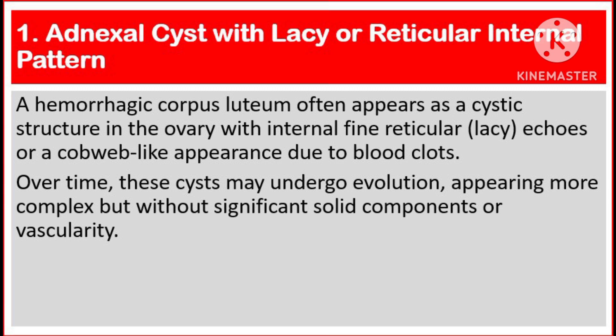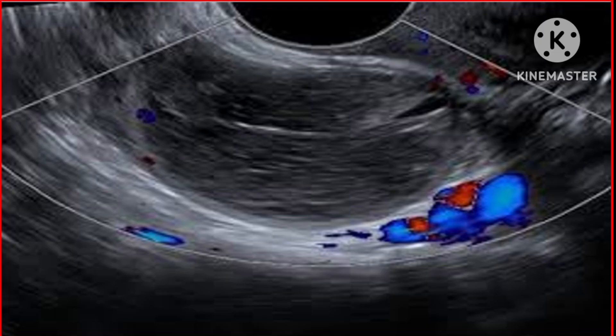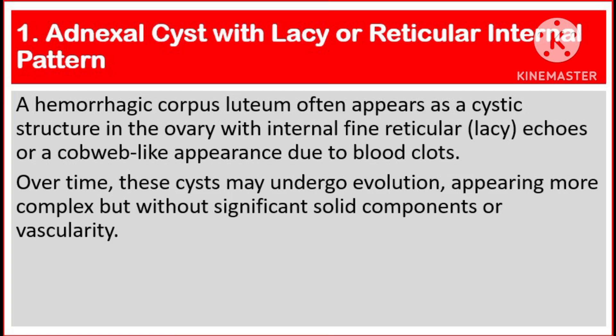Number one, adnexal cyst with lacy or reticular internal pattern. A hemorrhagic corpus luteum often appears as a cystic structure in the ovary with internal fine reticular echoes or a cobweb-like appearance due to blood clots. Over time, these cysts may undergo evolution, appearing more complex but without significant solid components or vascularity.